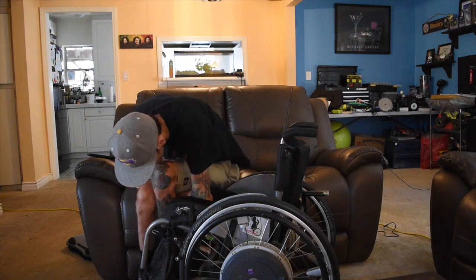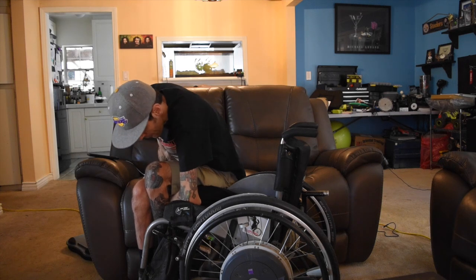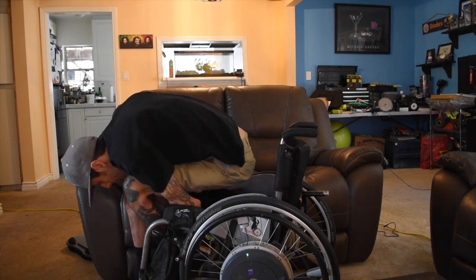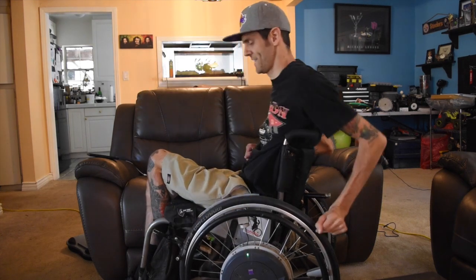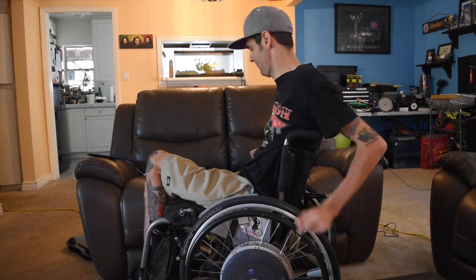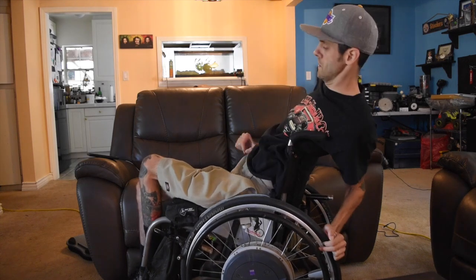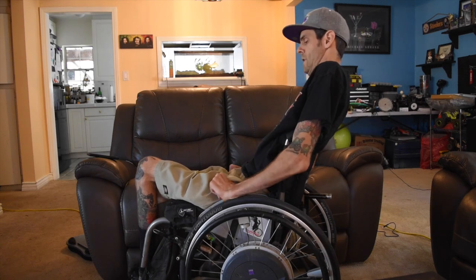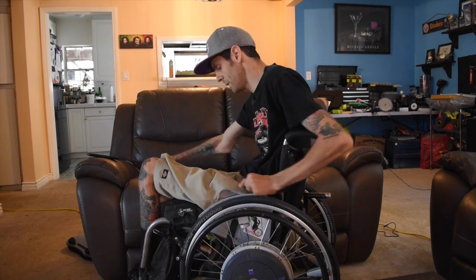So I'm gonna do a little push and then lean forward or slide my elbow forward. And then one big push, up and over. Whoop, almost went too far on that one. Was trying to show how big to go. I actually hit this side of the push thing of my side guard. So same thing, I'm just adjusting a little bit.